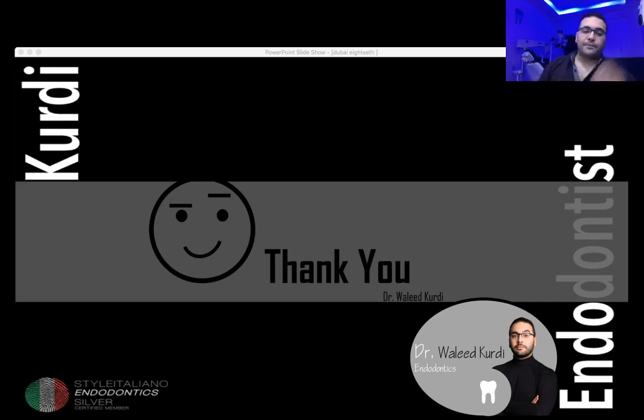For the power, I will tell you a catchy secret. They have 2 powers, higher power and smaller power. You can use the smaller power when you are touching the file, and the higher power when you are removing the dentin.